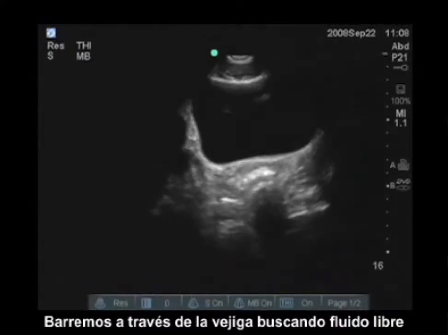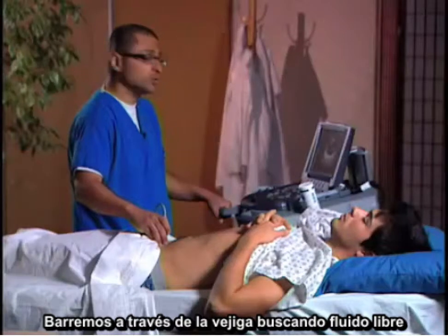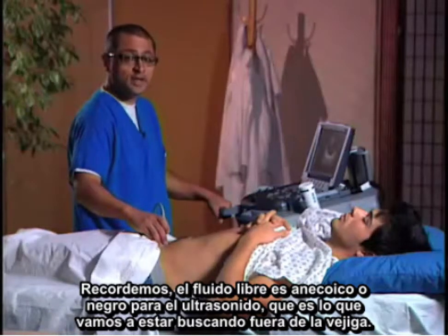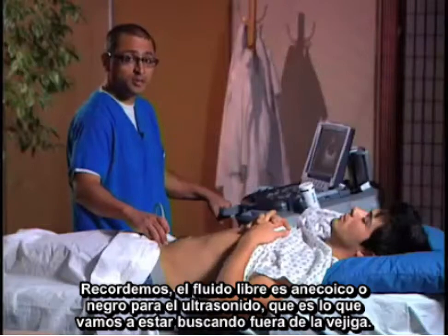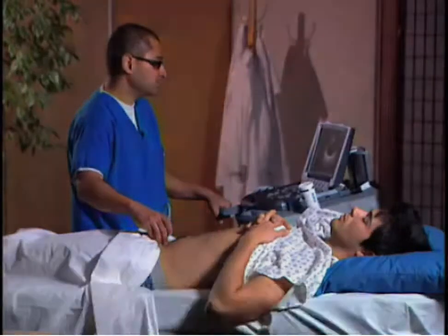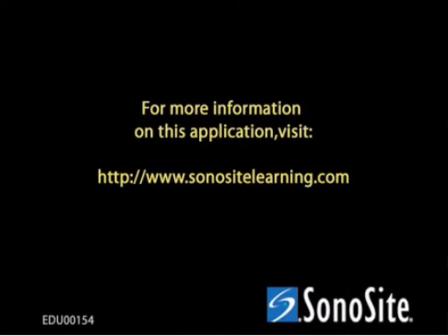As you're scanning through the bladder, you're looking for free fluid. Free fluid is anechoic, or black, on ultrasound — so that's what you're going to be looking for outside of the bladder. Thank you.